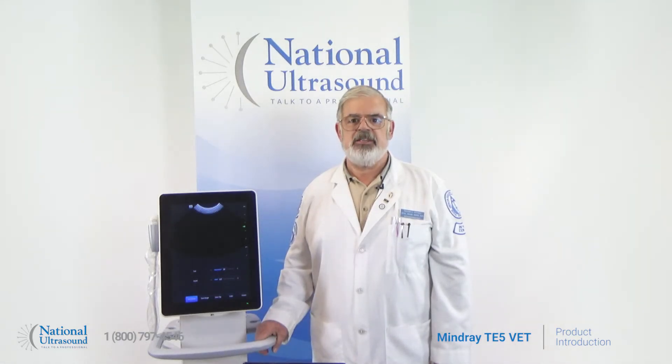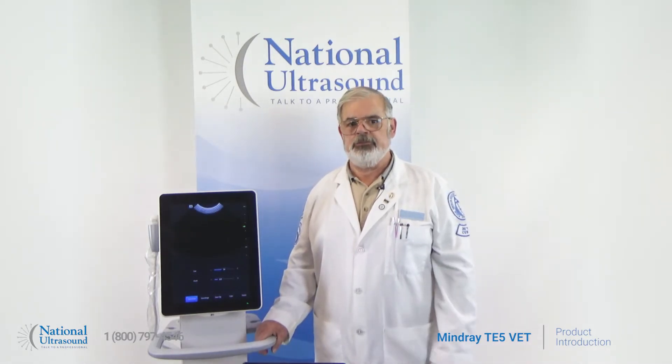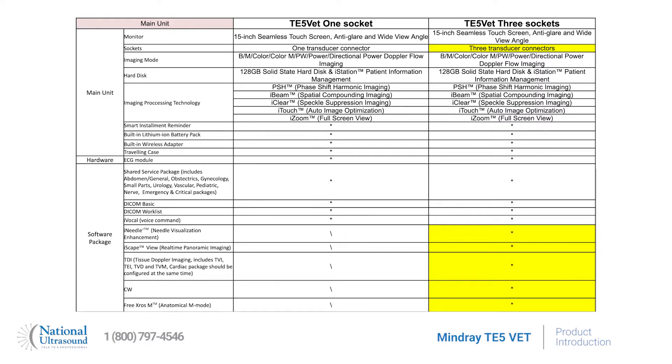Its user-focused design still includes a 15-inch seamless touchscreen with anti-glare and wide-angle view. Choose between the one-probe connector model or the three-probe connector model depending on your practice needs.